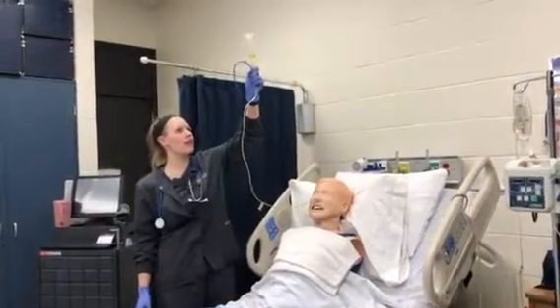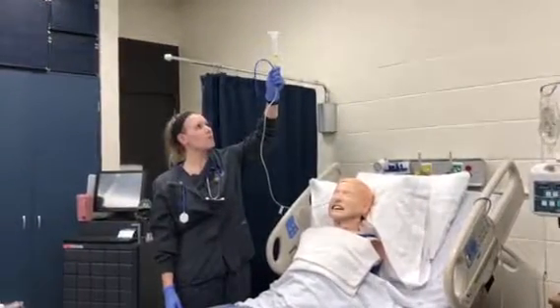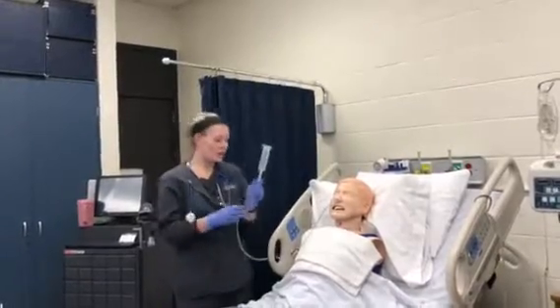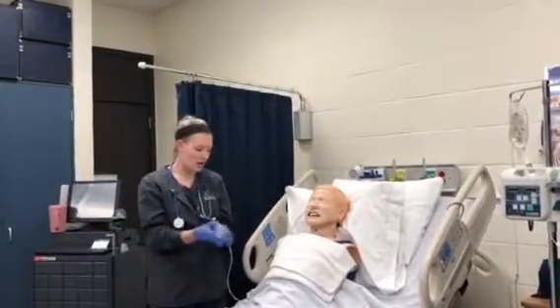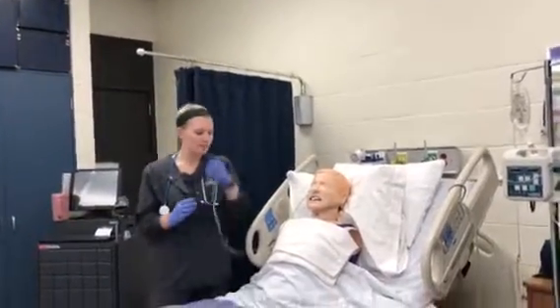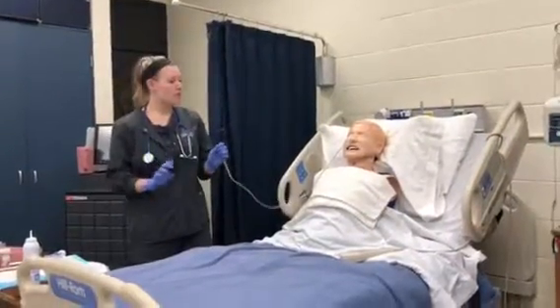It's always important to flush so you get all that med through that tube and into their system. And then you would attach it back, or just put this little stopper in the hole. You would not attach it back to suction until 20 to 30 minutes after, just so we don't suck back out those contents.